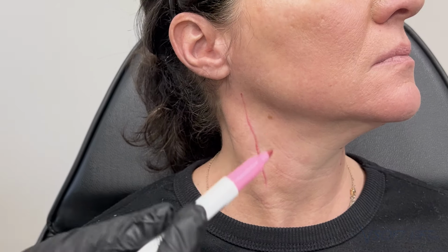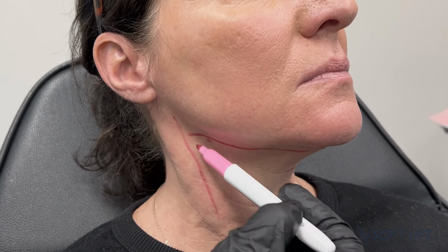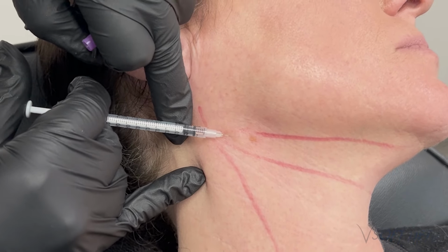Hey everyone, it's Crystal here, and today I am treating a patient with PDO lifting threads in the neck. So as you can see, I just kind of marked the areas where I want to go.